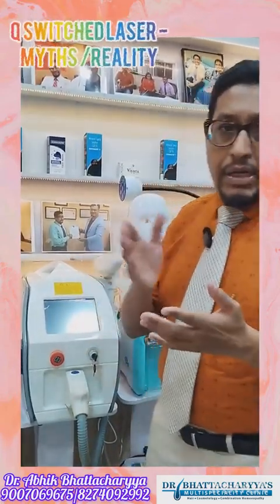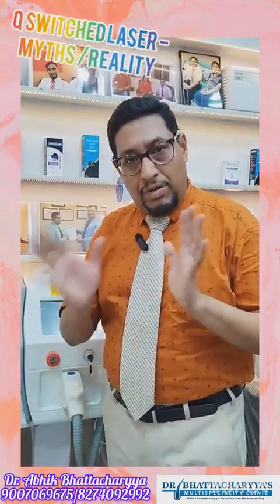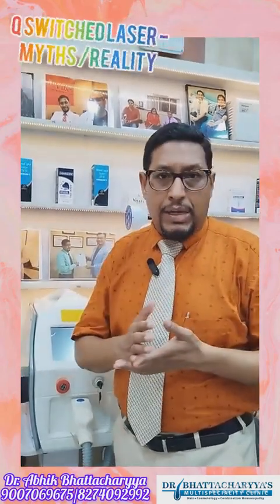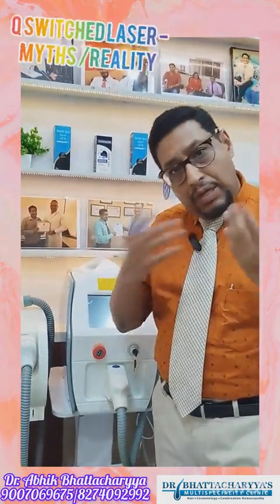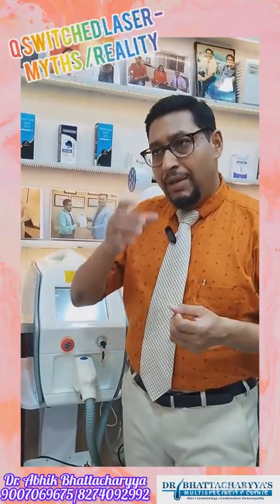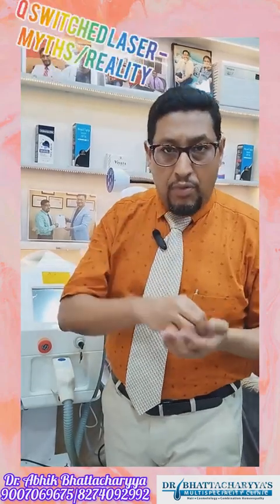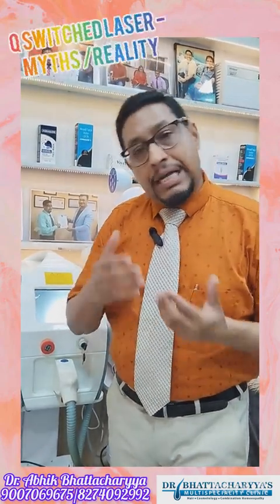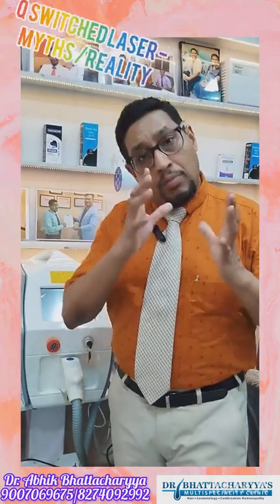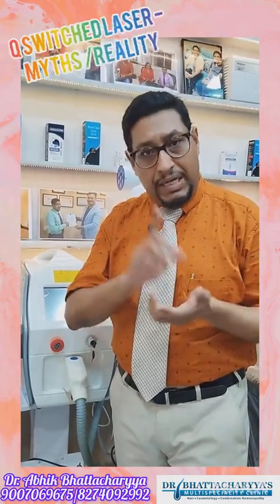So all the pigmentary lesions get divided into small pigments, which will be drained by your body. Ultimately, it doesn't happen in a single session. If you expect that a single session will give a beautiful result, that is not true. It will help, but it definitely needs subsequent sessions, maybe 4 to 6 or slightly more, depending upon the conditions of the tattoo, the pigment, and the chromophores also. It needs the sessions to reduce the pigment, but it will reduce.